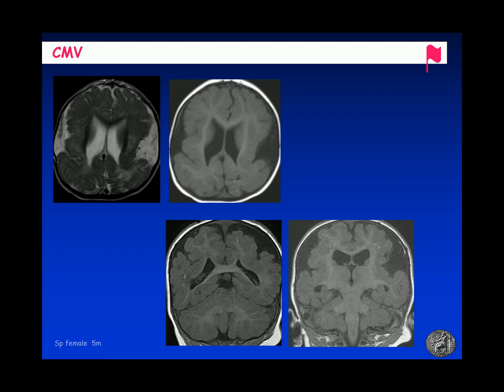And they are bright due to their presence on a matrix with high content of hydrogen, so these calcifications affect the T1 relaxation time of this matrix.